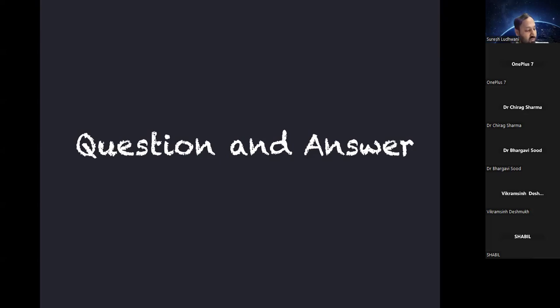So what you will do? Lekholm and Zarb classification. Okay. Anything else? On the CBCT, we can also use the Hounsfield HU values that are given in it. Understood. Now, there is a scenario.